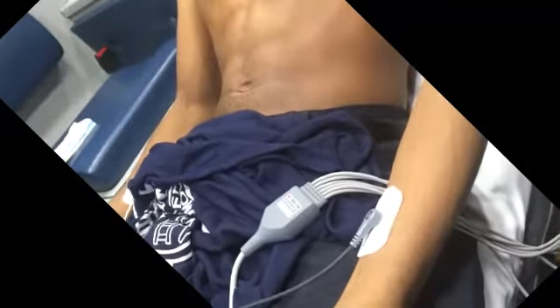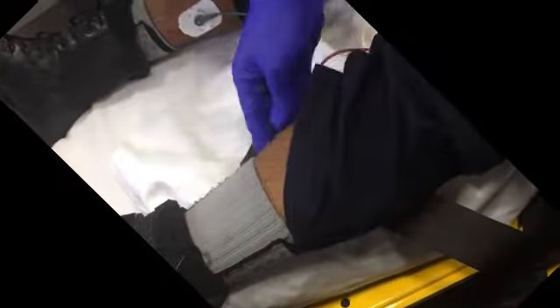This is a demonstration of how to properly acquire a 12-lead EKG and proper pad placement. For demonstration purposes only, we'll assume the patient is in a semi-recumbent position, as well as that the skin has been prepped prior, wiping away any dead cells and body lotions before applying the electrodes. The limb electrodes, notice the placement of those in the outermost portions of the limbs. We now stair step down, identifying V1 in the fourth intercostal space on the patient's right, and apply that there.